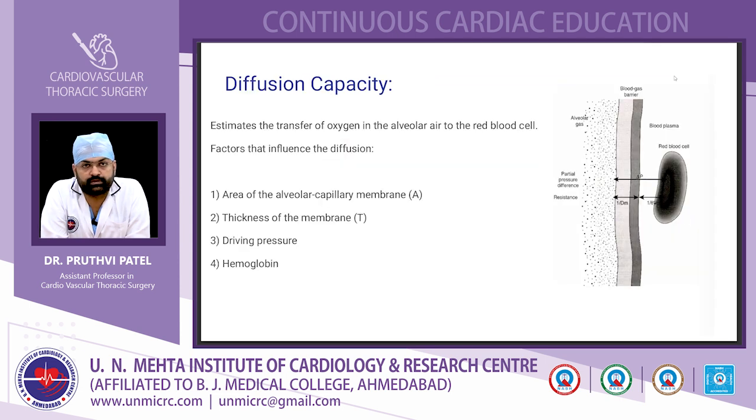The next test is diffusion capacity. This test estimates the transfer of oxygen from the alveolar air to the red blood cell. The factors that affect the DLCO are the area of the alveolar capillary membrane, thickness of the membrane, driving pressure, and hemoglobin of the patient.